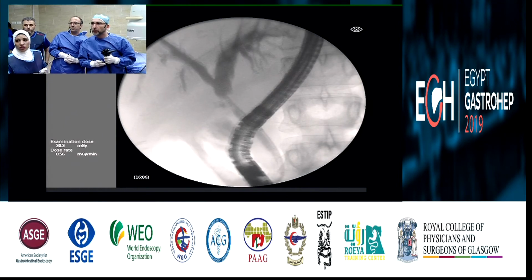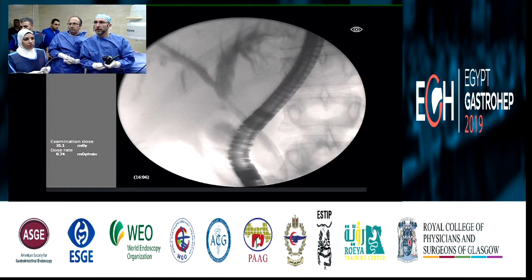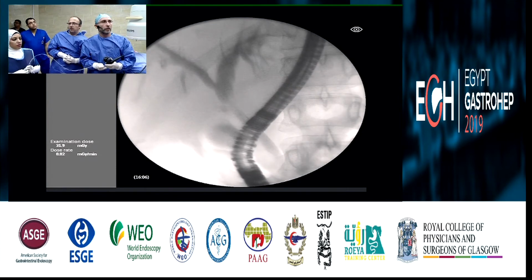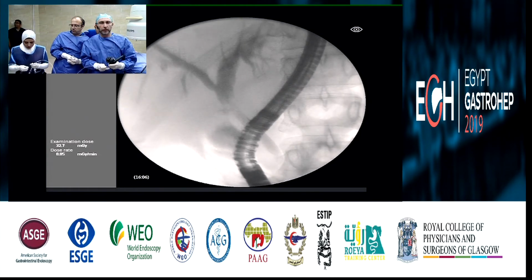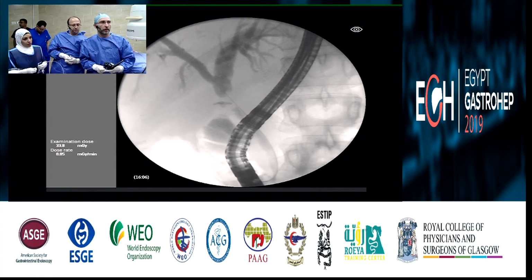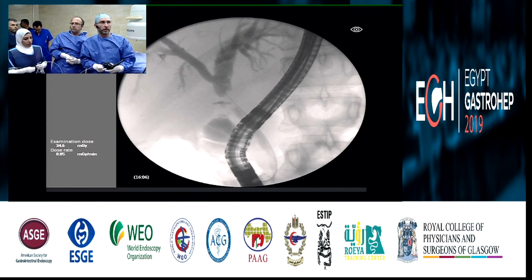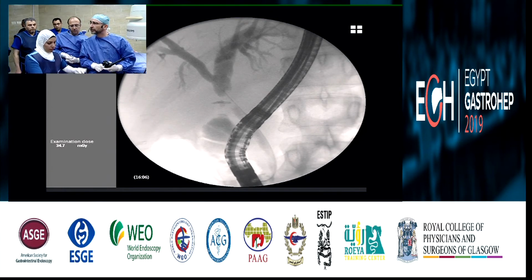Okay, so how long after the surgery did this develop? I mean, back to the history, is this 3 months, 4 months, 6 months after lap chole? Do we know exactly when surgery was done? In June, so 6 months. So it's safe to dilate the stricture, I think. Now it seems awfully tight to put 2 stents, one metal and one plastic, through that tight stricture. It seems that it's going to be a little difficult to pass 2 stents through that very tight stricture without dilatation.